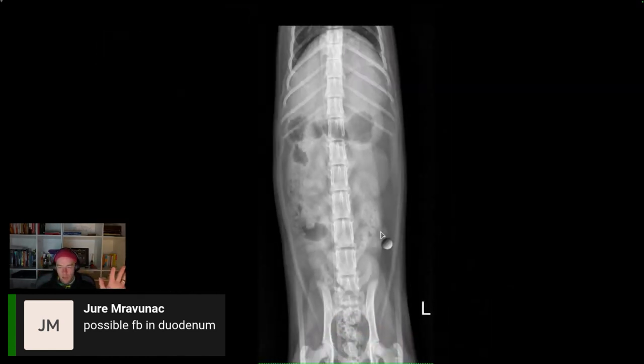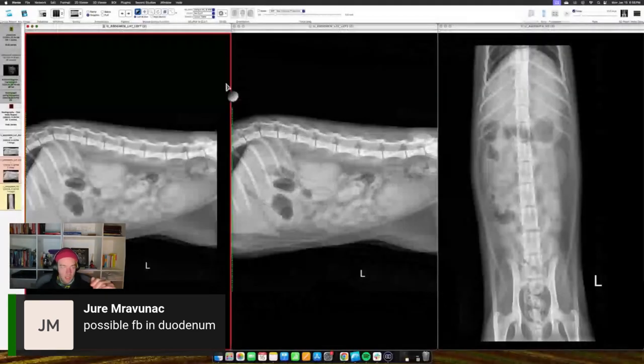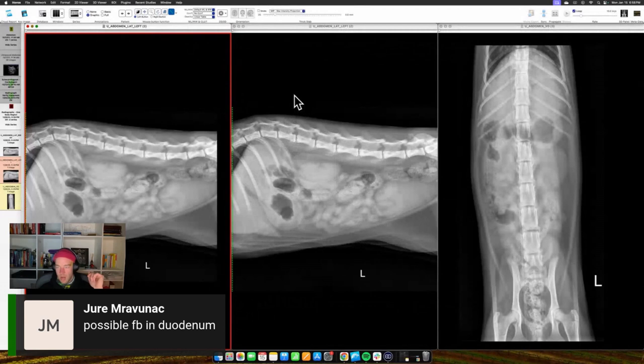They're in the caudal, the middle, the cranial, caudal, middle, cranial. You flip the cat over, and you've got some little squirrelies down here. They're up here. So they're all very nice and gentle, and they're in their area, totally empty, but now you've got all this fluid. So now you've got to look for a plumbing problem that's upstream. If you look at the pylorus, that's got gas, and that's okay. Then the colon comes through here and dips down like this. But this structure right here is a duodenal foreign body.